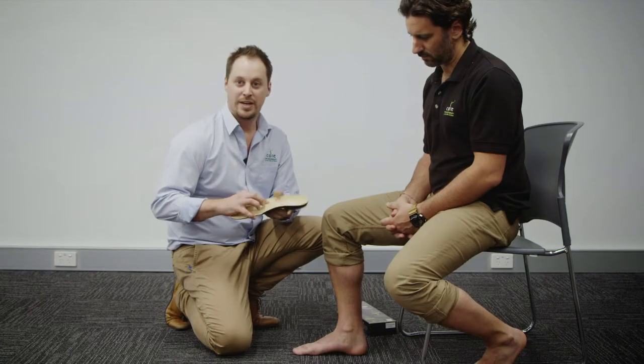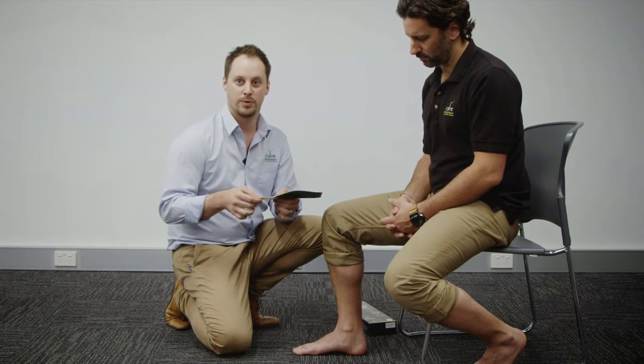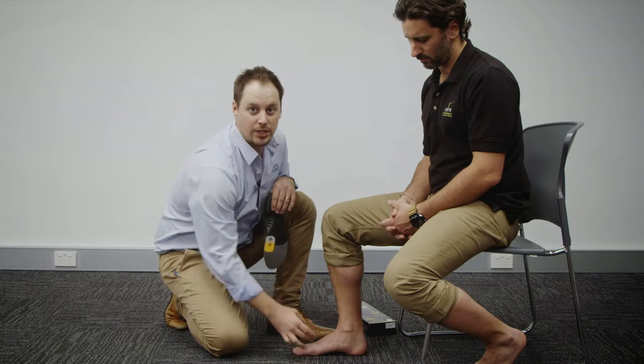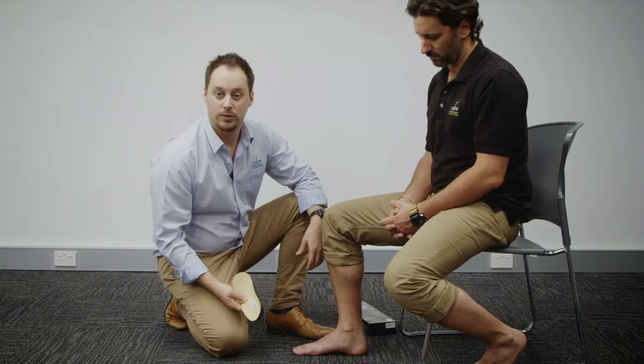It's also got a metatarsal dome in the middle here, which allows for better load transfer of the foot on the orthotic as well. What we can see here with Nick's foot is that he's got an over-pronating arch. We're going to fit the orthotic underneath, so let's have a look at that in action.